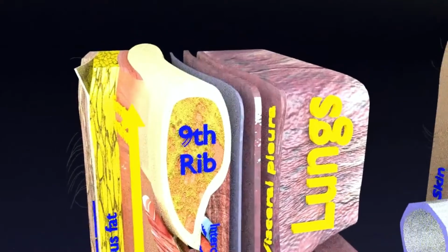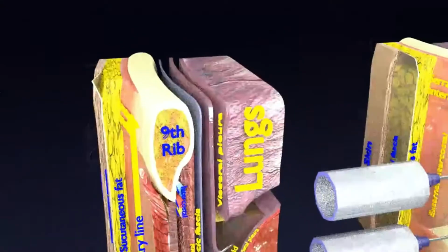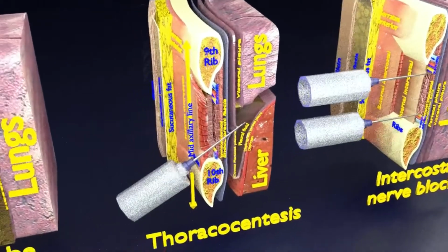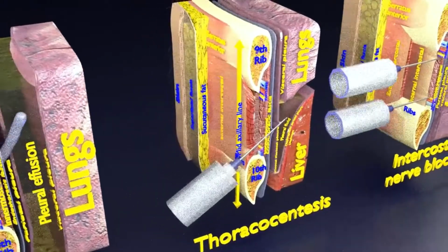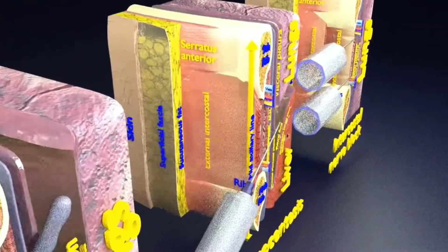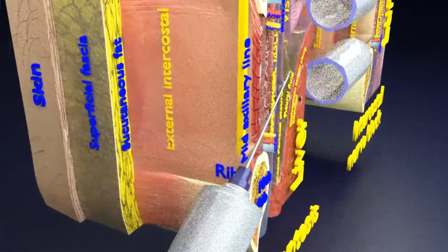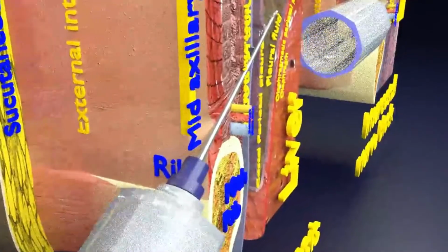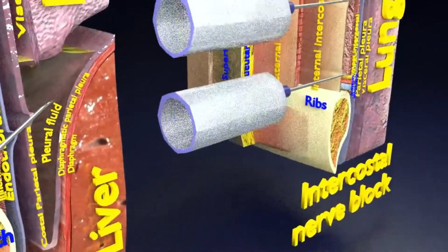The fluid may drain through the needle, or the doctor may slide a small plastic tube over the needle to drain the fluid. After the removal of the fluid, the needle and the tube are removed and a bandage is placed over the insertion site wound. The wound closes on its own without the need for stitches.